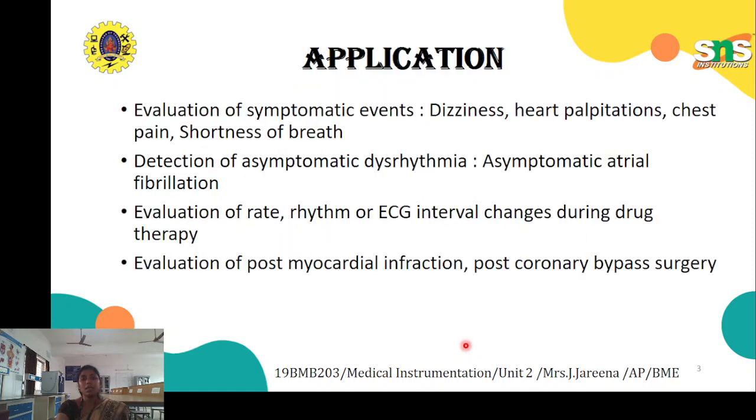So this is the main overview of the Holter monitor. Now let's see the applications. As I told you before, we can use the Holter monitor when people have unexpected problems, that is, asymptomatic heart-related disease. Not only asymptomatic, even symptomatic problems we can identify. Here I have listed a few of them. First, evaluation of symptomatic events.